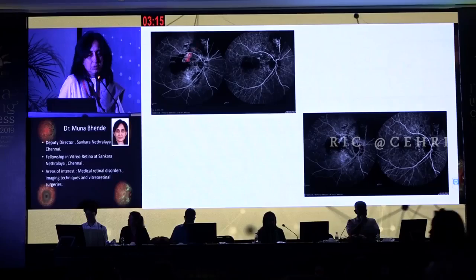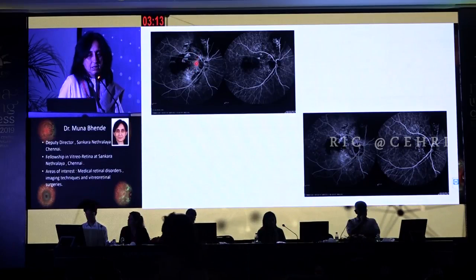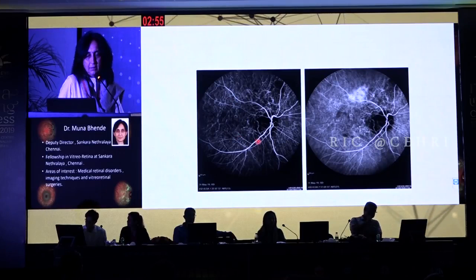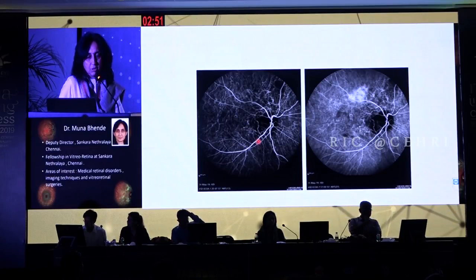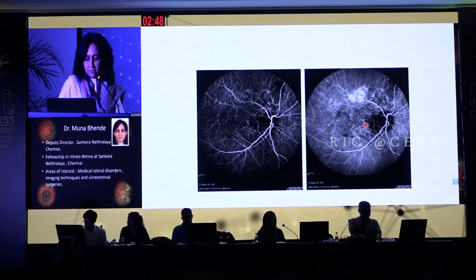This indicates that polyp regression alone may not be a sign of complete resolution. In another patient, you see a large branching vascular network coming from the peripapillary region with active polyps on ICG going above the disc. After treatment there is partial regression with about half the polyps gone, and after multiple treatments barely any polyps are visible — the end point of complete regression of polyps — but you still see the vascular network is persistent.